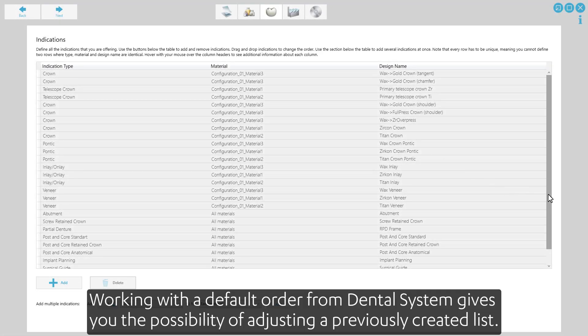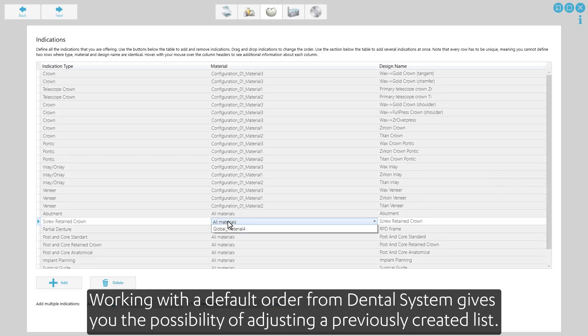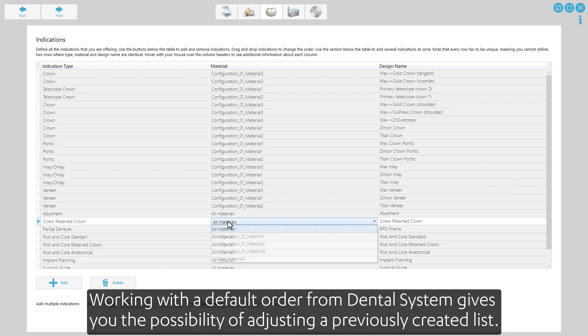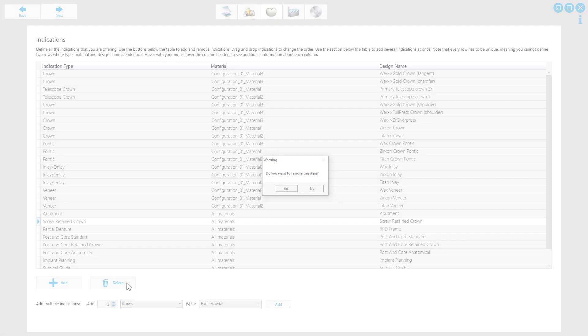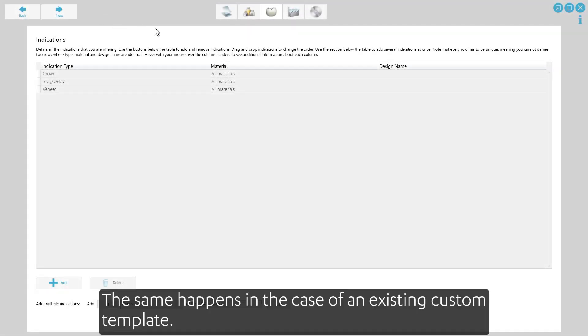Working with a default order from Dental System gives you the possibility of adjusting a previously created list. The same happens in the case of an existing custom template.